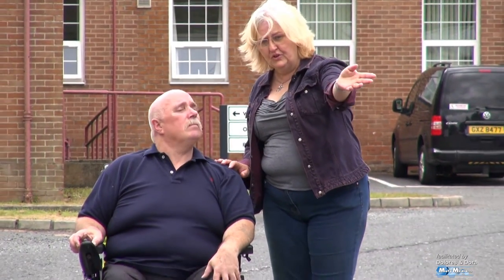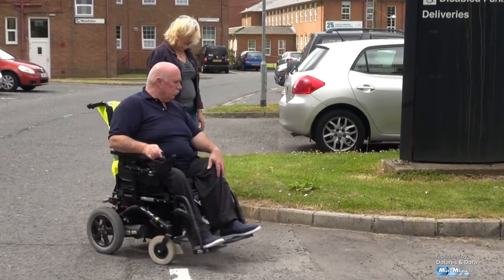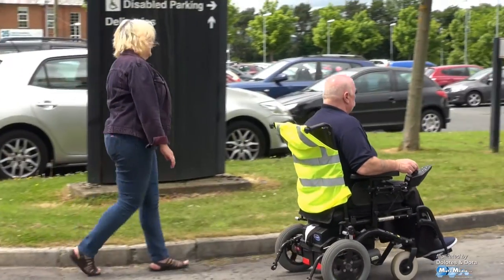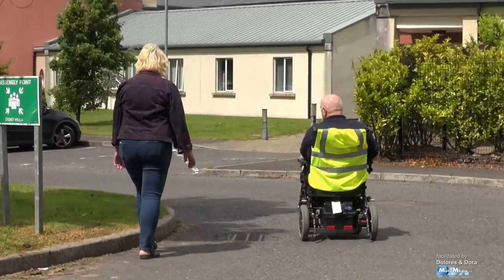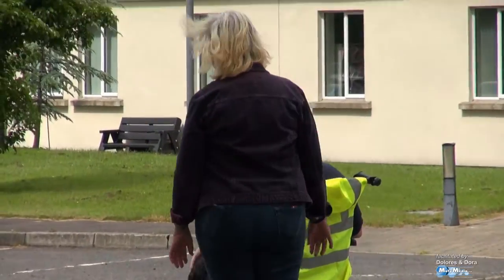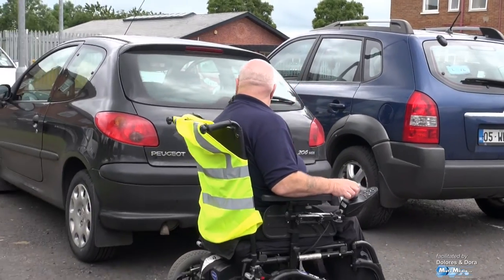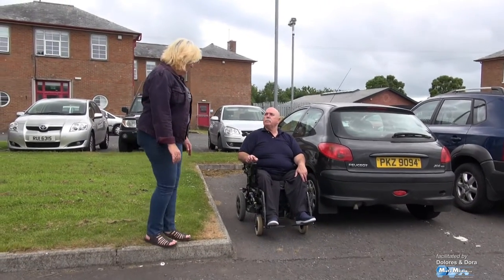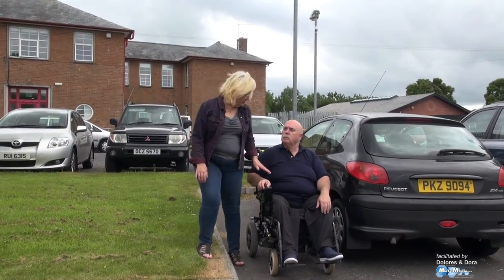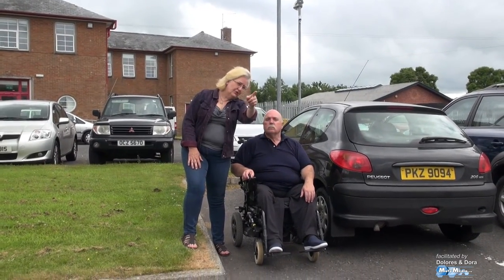David, proceed and turn the corner to the left. Be aware that there's a drain cover there as well — stick as close to the pavement as you can, just avoid it. David, I want you to slow down here, stop and reverse into this space here because we're going to cross the road. You're in a good position now to observe the road. Look again to see there's nothing coming and cross directly over to the dropped curb over there.